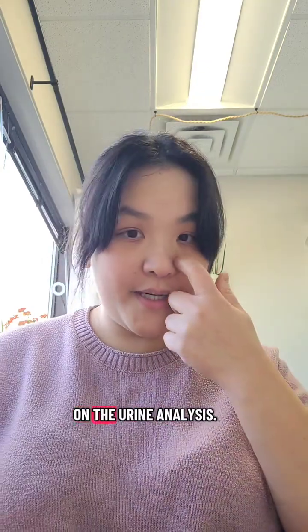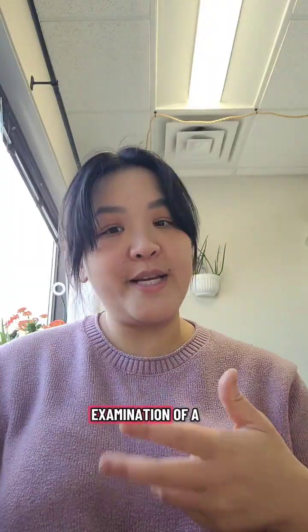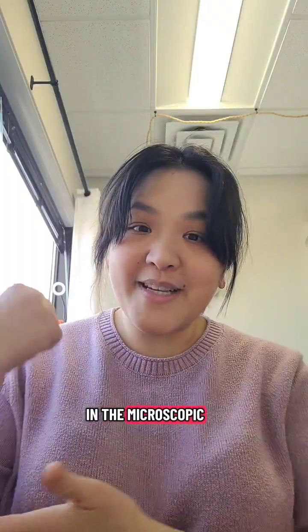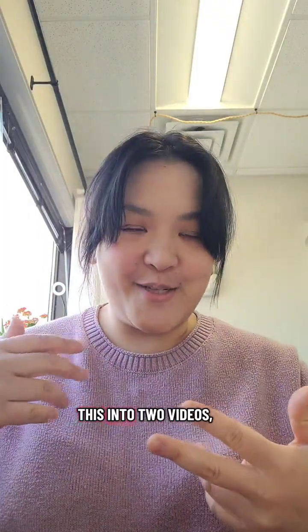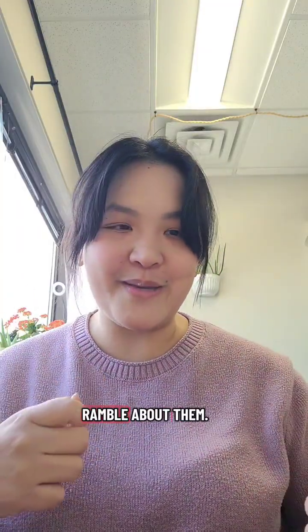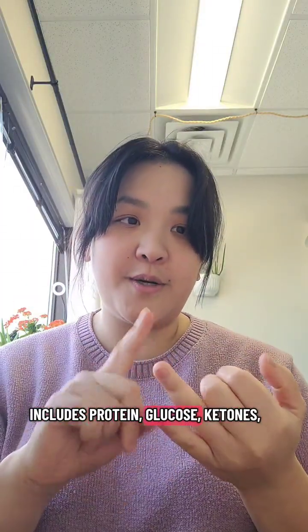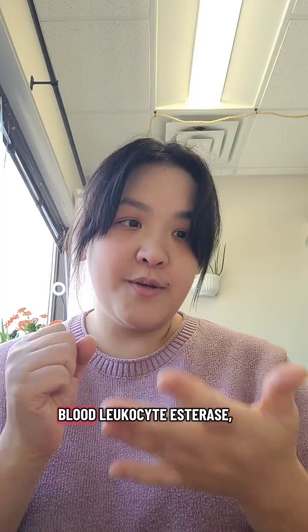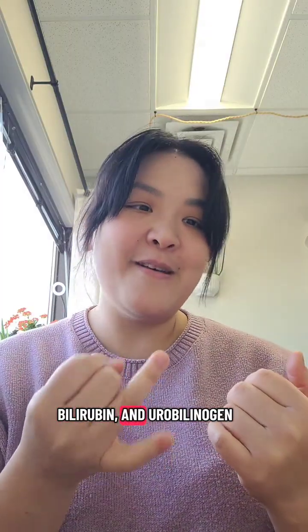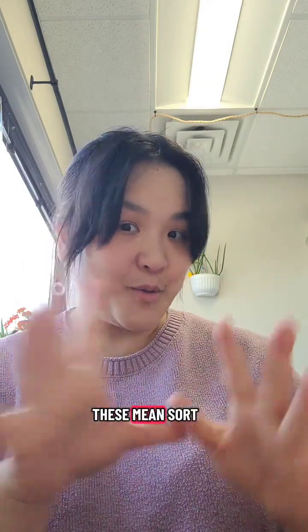All right, part 2 on the urine analysis, we're going to go over the chemical examination. Now, the chemical examination of a basic urine analysis is a lot more extended than the physical exam and the microscopic exam, so I might make this into 2 videos depending on how far we can get on each of these markers and how much I want to ramble about them. But typically, the chemical analysis portion includes protein, glucose, ketones, blood, leukocyte esterase, nitrites, bilirubin, and urobilinogen in the analysis. And all of these mean sort of separate things.